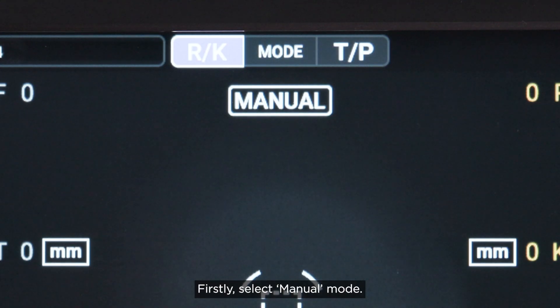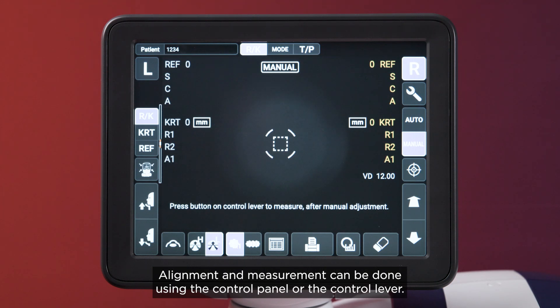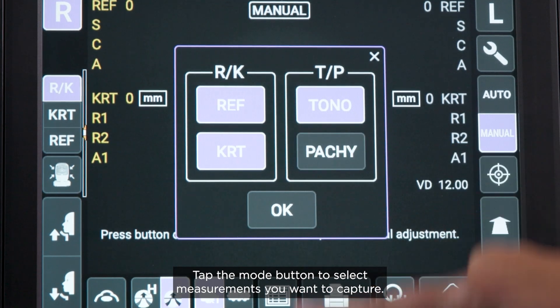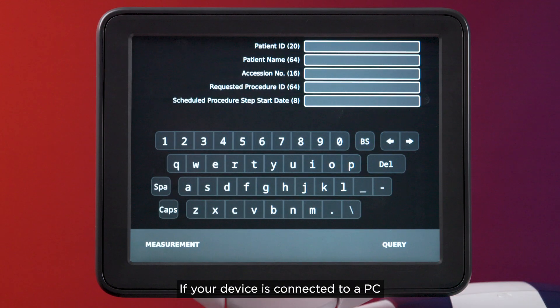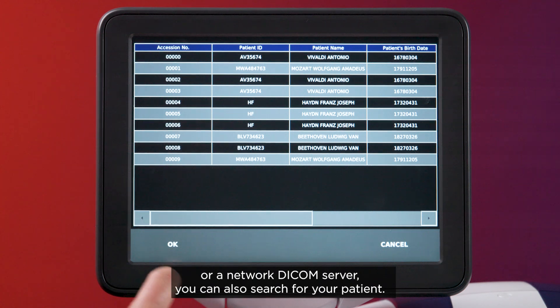Firstly, select manual mode. Alignment and measurement can be done using the control panel or the control lever. Tap the mode button to select the measurements you want to capture. A patient number is automatically generated, or you can enter a patient ID. If your device is connected to a PC or a network DICOM server, you can also search for your patient.